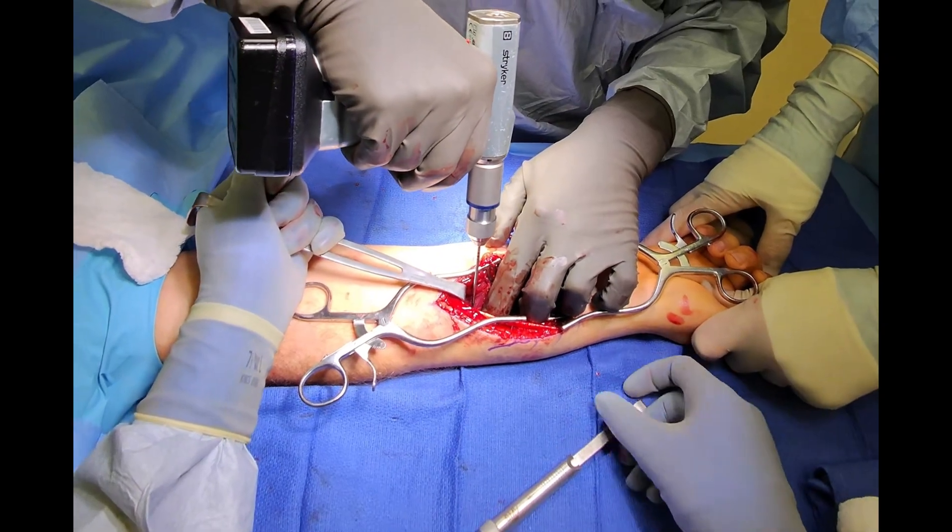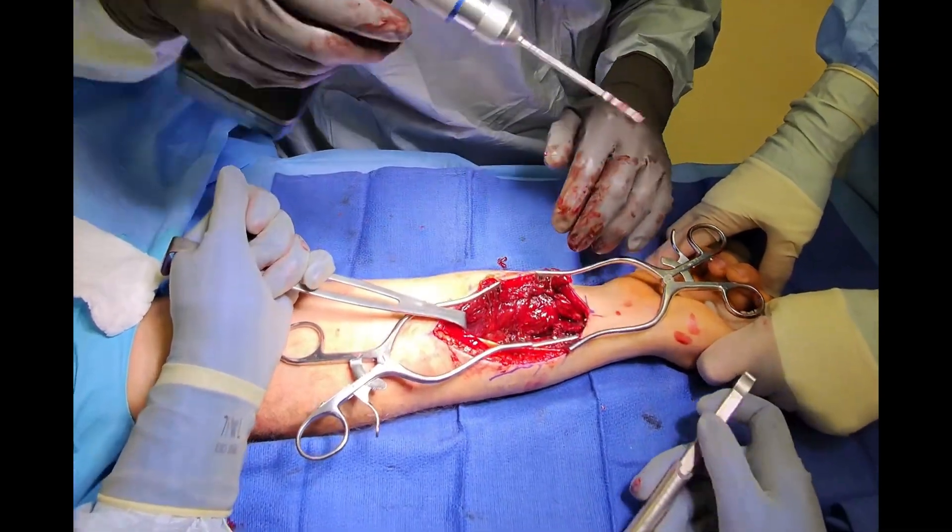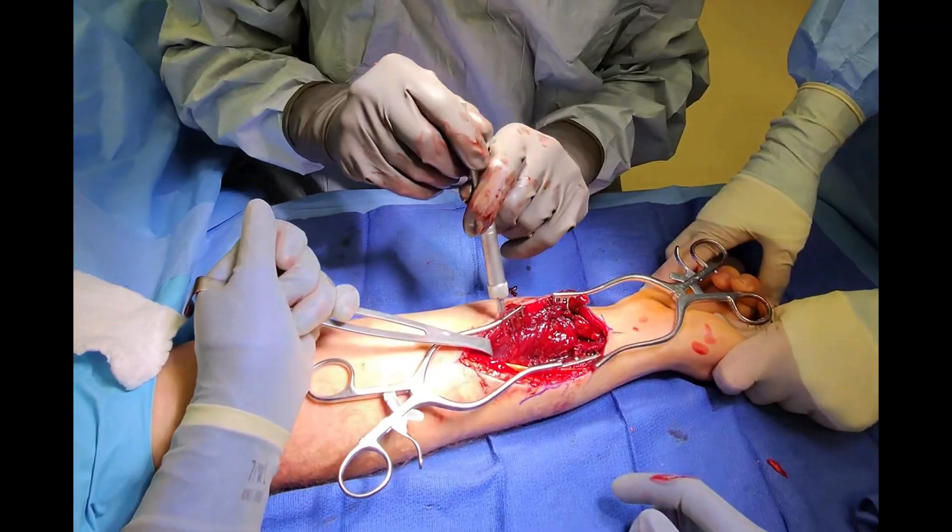This process of drilling, measuring, and screw driving is repeated until adequate fixation is obtained throughout the length of the plate.